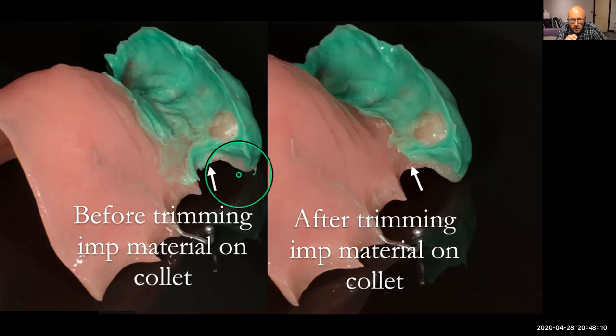If you look closely here, I take a scalpel blade and I cut this section away from that collet. It's the same as when I'm adjusting the denture, I remove that so that it is totally free now. And that means that Rowan is not going to add material in that area. He's not going to add plastic to the denture there.